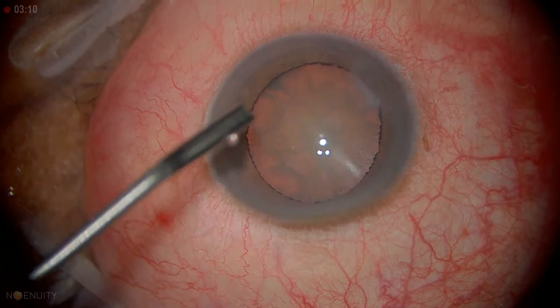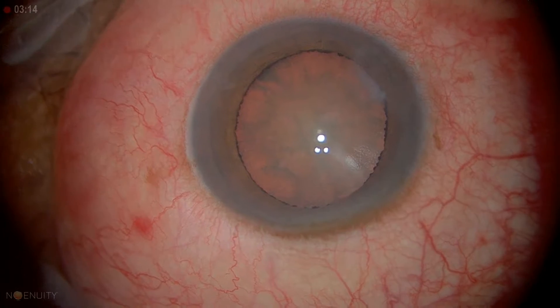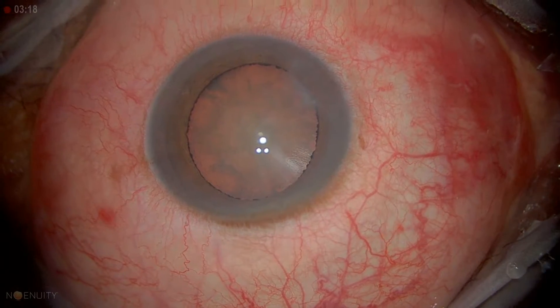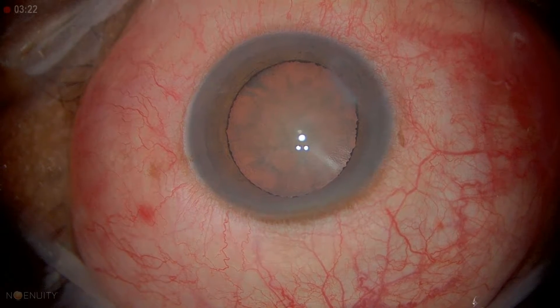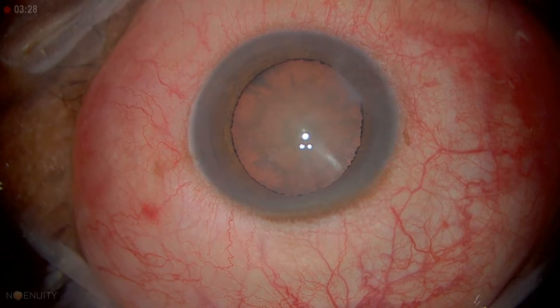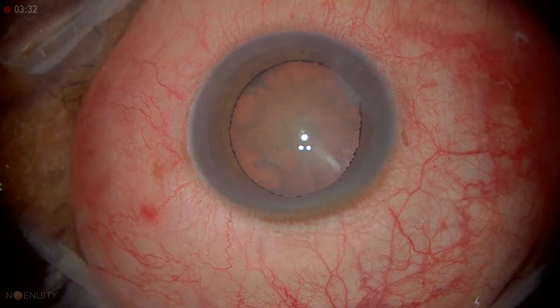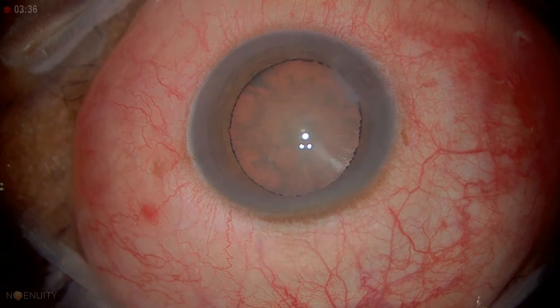We're going to try to do a stop-and-chop technique for this patient. We'll start with the standard central groove, but then switch to horizontal chopping — just to show how we transition to that technique, which is good for denser lenses and useful in high myopia cases.